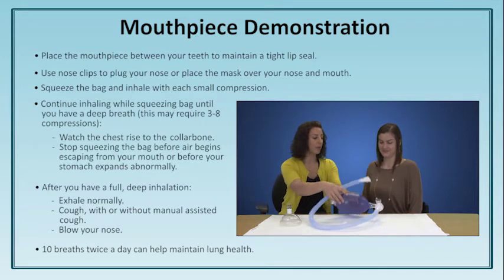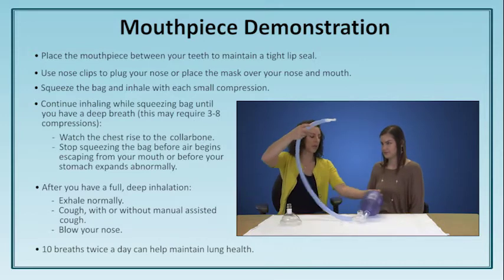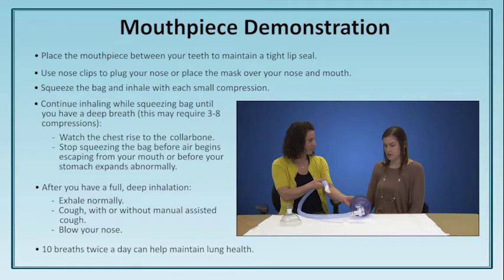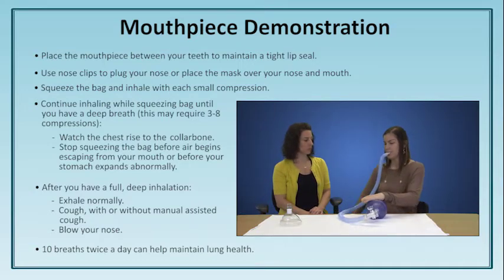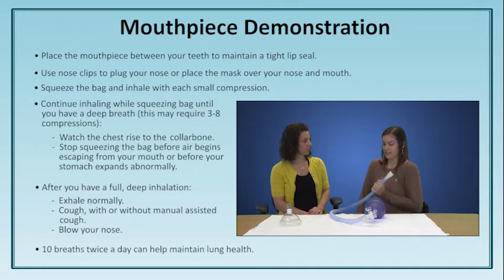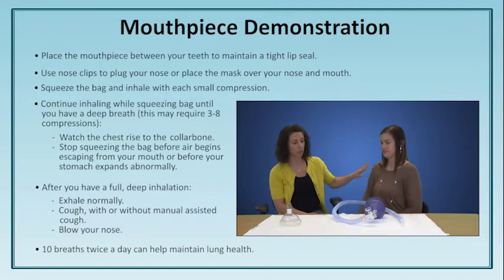I'd like you to try it on your own with the mouthpiece. The tubing is nice and long so you can place this wherever you'd like — where do you think would feel best for you? On the table. I'll let you try it. Good job. Notice that Emma was able to do four compressions with the bag on the table and still get full chest rise all the way up to her clavicles.